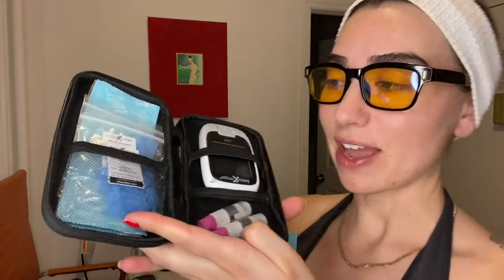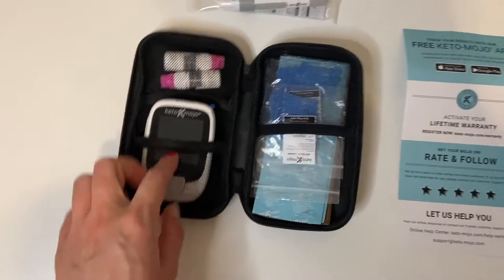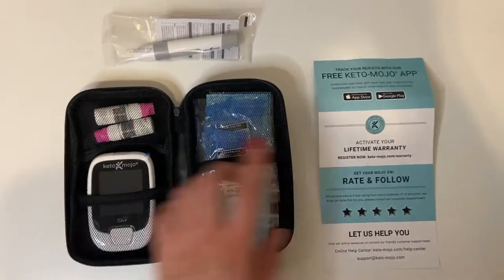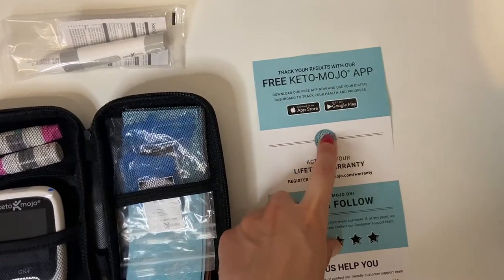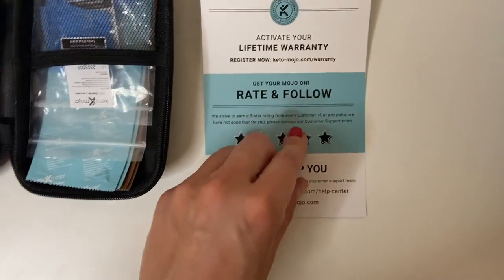The app reads your numbers and keeps them all in one place. My friend had this and I was like, oh my god. Now I have it, I feel so official. Here's kind of everything, and then we got some instructions — but who reads instructions? So I just wanted to lay it all out for you — this is what you get inside the box. Let's check our ketones! First thing I'm going to do is download this app. You get the app for free, and it also says it's a lifetime warranty, which is good to know.